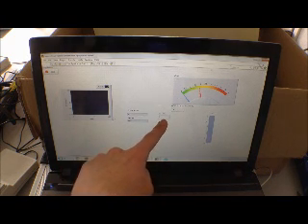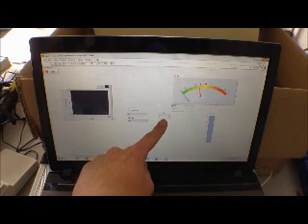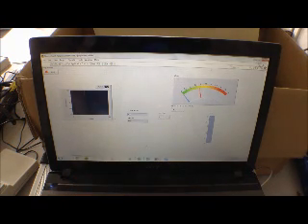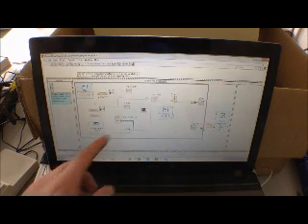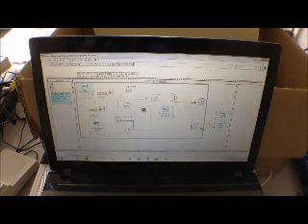There is a hot and cold sensor as well, hot and cold display as well. This shows the temperature difference which can be applied to your equation, or will be applied to your equation. What we're looking to see is the heat flux as well, and there's an indicator for that, and as you can see, it is wired up through the same kind of means as the RTDs.